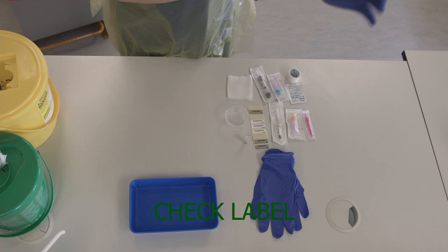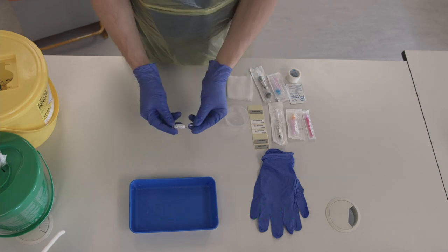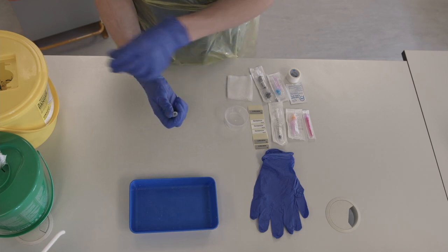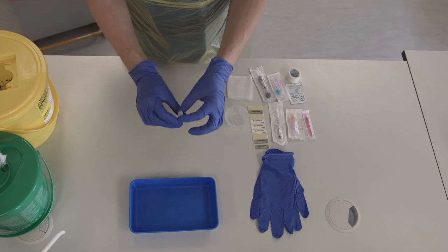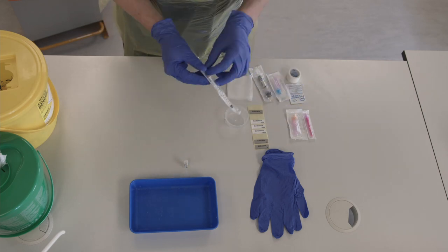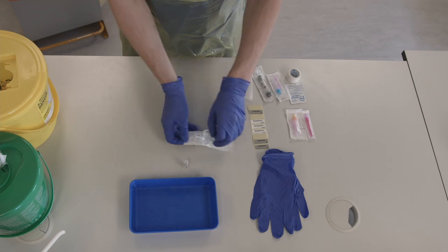Then gather the equipment you will need for your tray. You will need an ampoule of lidocaine — check the label to make sure it is in date. Snap off the top, then take a 1ml or 2ml syringe, an orange subcut needle, and a filter needle. Open the back of these packets.